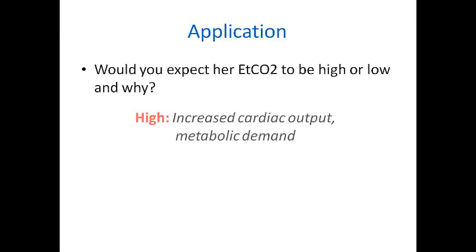Although the patient is breathing at an elevated rate, which was the same as we had with our patient before, this patient's underlying state is abnormal. The patient has an increased metabolic demand, so they're creating more energy, using more oxygen, and creating more CO2 in the output. They also have an increased cardiac output and stress within the heart and cardiovascular system. This patient's end-tidal CO2 is likely going to be high.